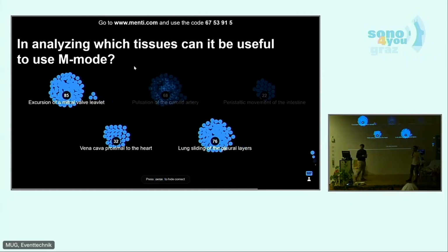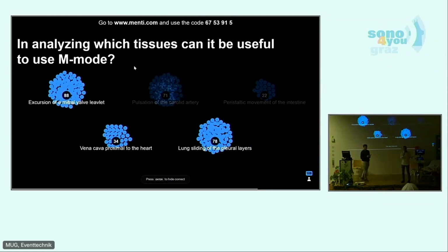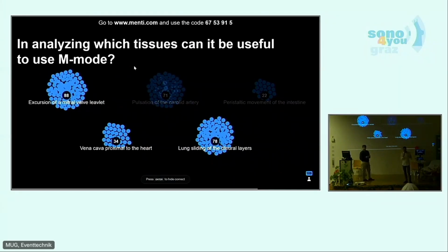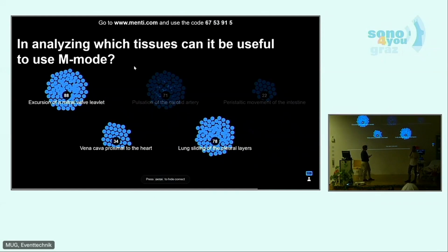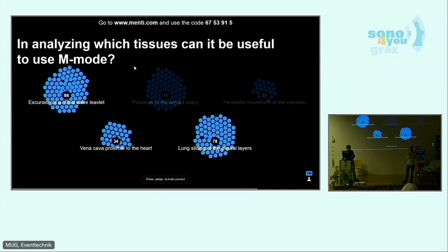So 3 choices were right. The excursion of a mitral valve leaflet, you do it actually in a very similar section. The vena cava proximal to the heart, you saw that in the presentation before actually. It can collapse a lot. And the lung sliding of pleural layers. Why not the pulsation of the carotid artery? The pulsation of the carotid artery is very little movement actually in the image. And the peristaltic movement, well, it's a slow movement. So it's not, and also we would not have any question to quantify it.